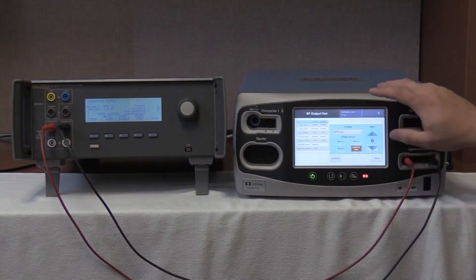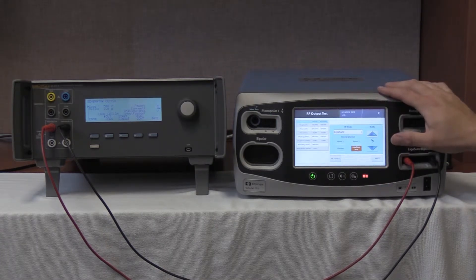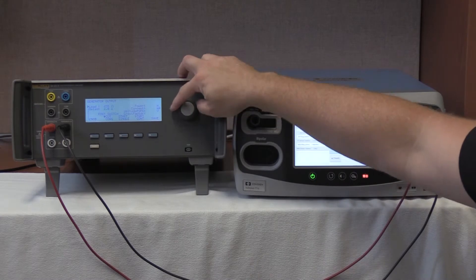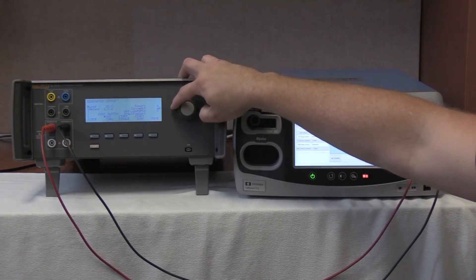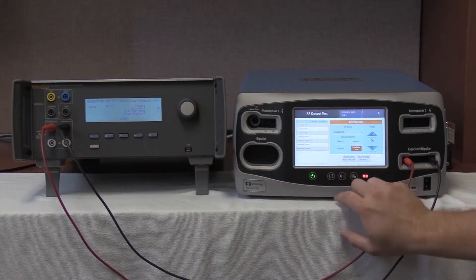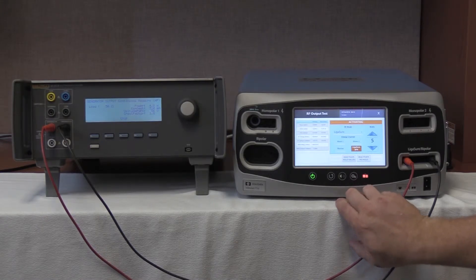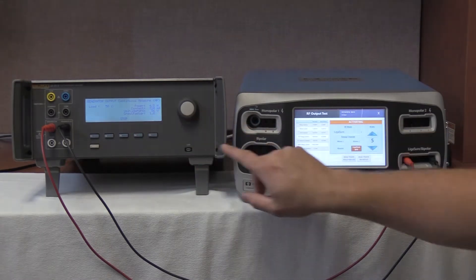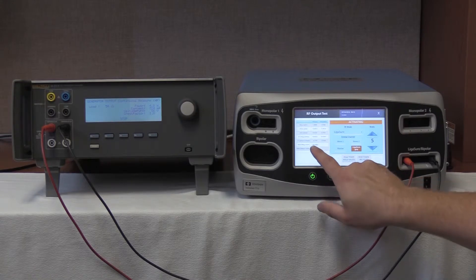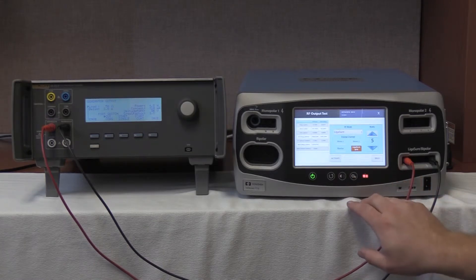We are now going to select ligature on the FT10 and go to 5 watts. On the QES3 we are going to select 50 ohms. Start continuous on the QES3 and press activate on the FT10. We are looking for 276 to 357 milliamps. We are reading 310 milliamps with an output of 315.3 milliamps — well within passing. Stop on the QES3 and deactivate, holding values on the FT10.